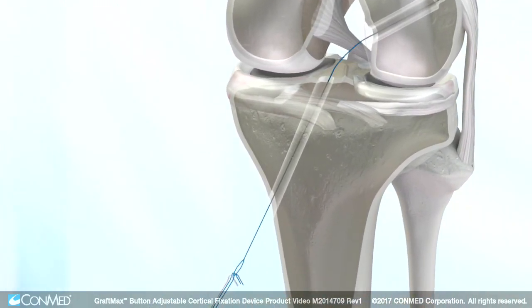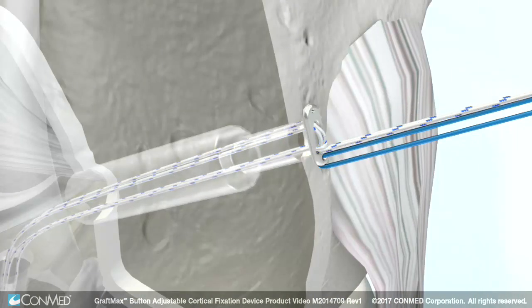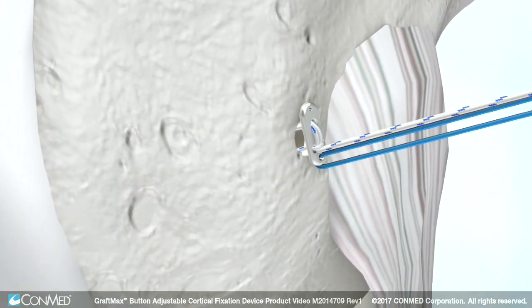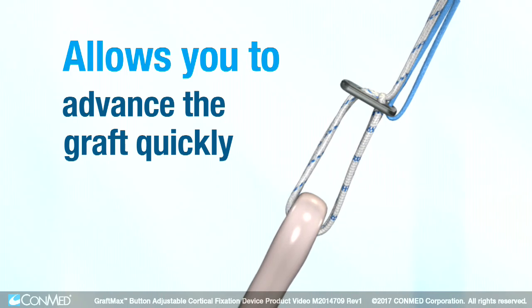Compared to fixed loop devices, GraftMax buttons are easier to insert, eliminate the need for tedious calculations, and allow the same implant to be used regardless of tunnel placement or depth. The single-step loop adjustability is also simpler than other adjustable buttons, allowing you to advance the graft quickly.